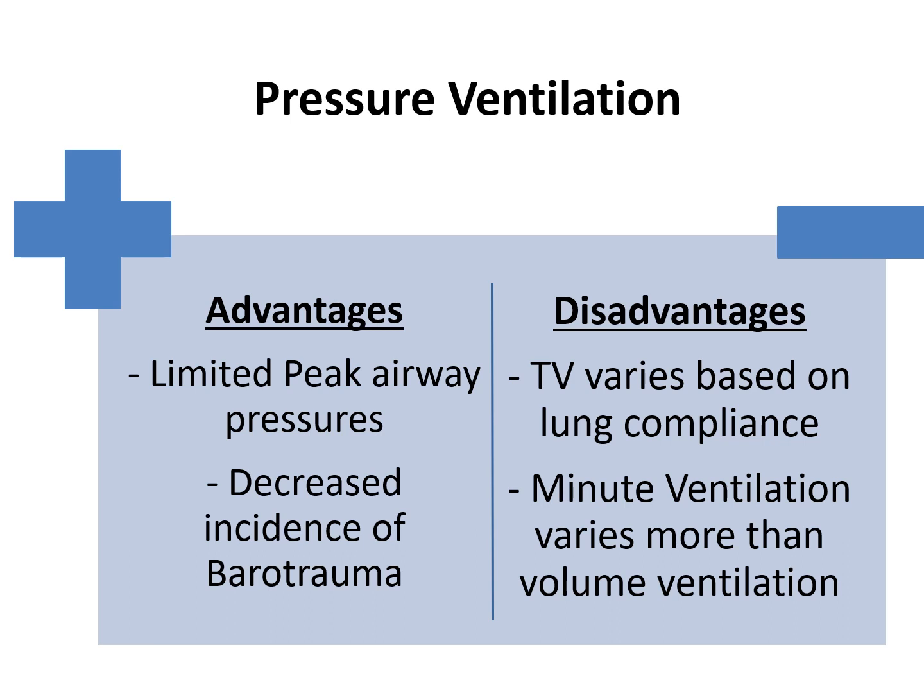So why do we care if the tidal volume varies? Because minute ventilation equals tidal volume times respiratory rate. A normal minute ventilation while resting is about 5 to 8 liters per minute, and it does increase with exercise. If the patient reaches that preset pressure with a small tidal volume of 200, then their minute ventilation will be inadequate, and therefore the patient will not be able to blow off CO2. So the rate or pressure may need to be adjusted.